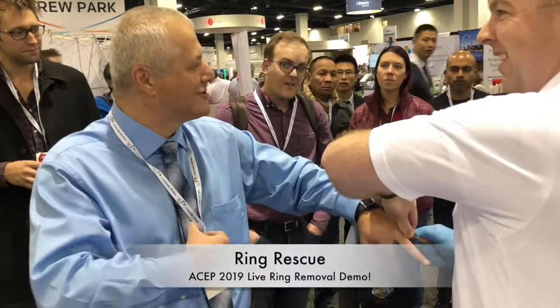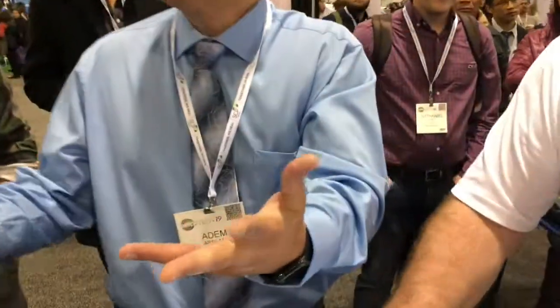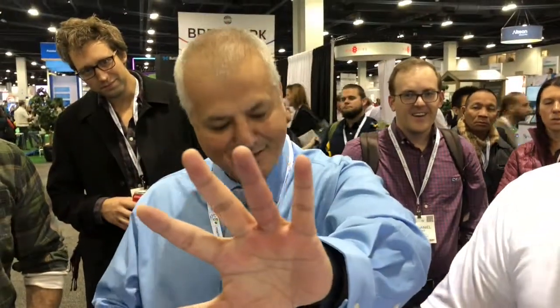Just wear it as a necklace with a ring. Wow, look at that! Holy cow. You don't even know what it looks like — I've tried everything. This is incredible.